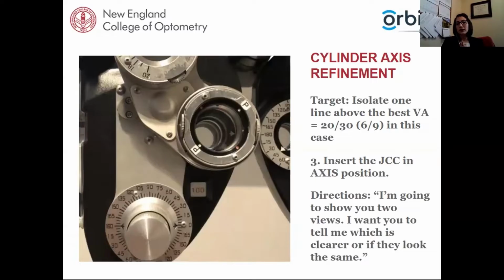The target that you use for this point is one line above the best vision that you were able to get on the initial sphere check. So for our patient, they were able to read 20/25, so we'll go to the 20/30 line. If your patient was only able to get to 20/30, you would then show them the 20/40 line. So it's one line above your initial sphere check visual acuity, and you isolate that one line.